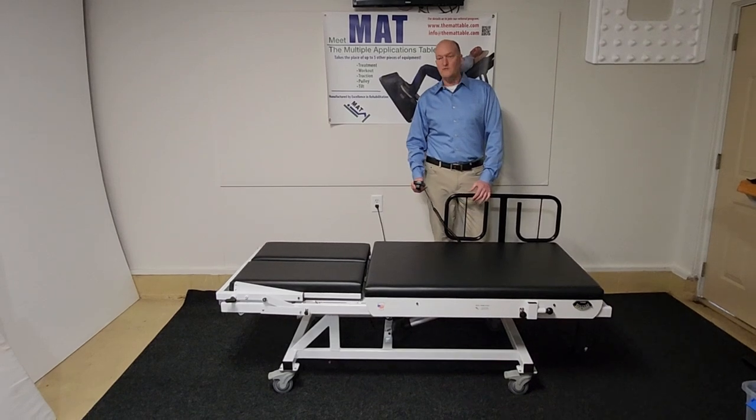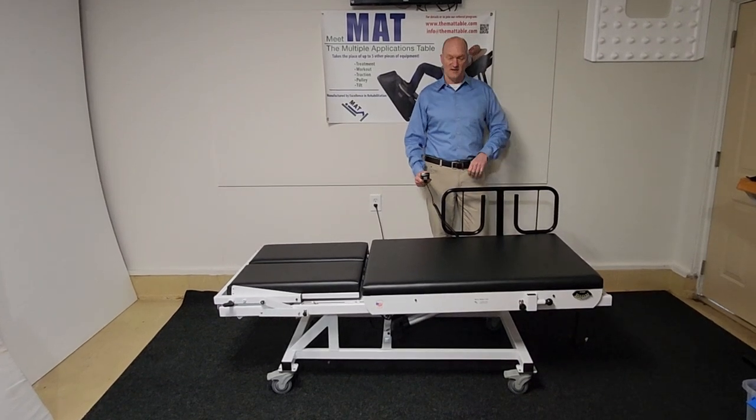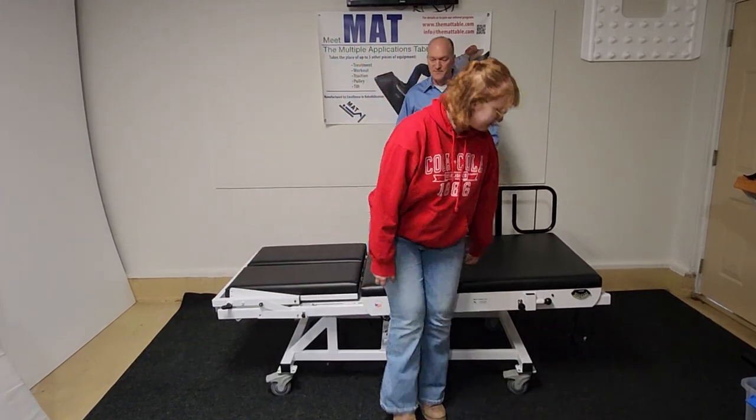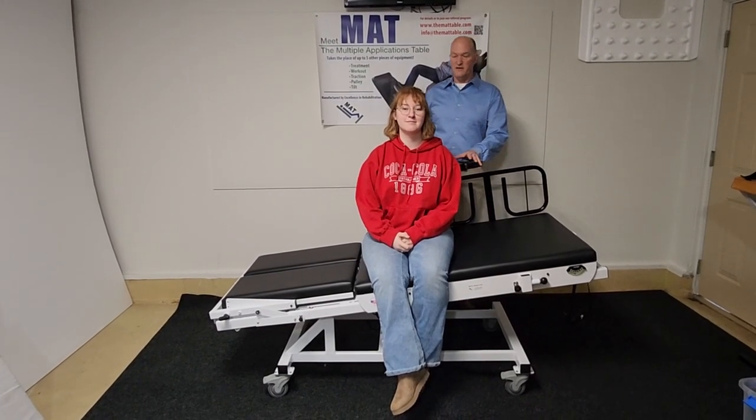You can also do different patient activities — have a seat right there. Such as if someone's had a stroke, you can do perturbations while they're sitting, and then do dynamic or static perturbations. You can hold here if you want to encourage a lean in a certain direction, you can do some reaching. That's the advantage of having a treatment table that tilts in either direction.